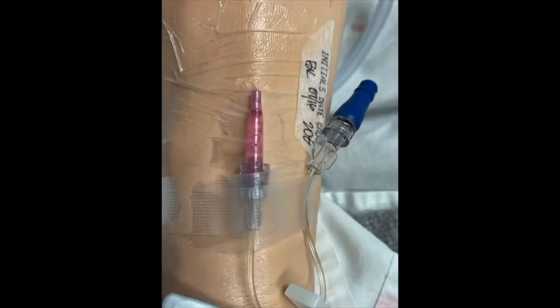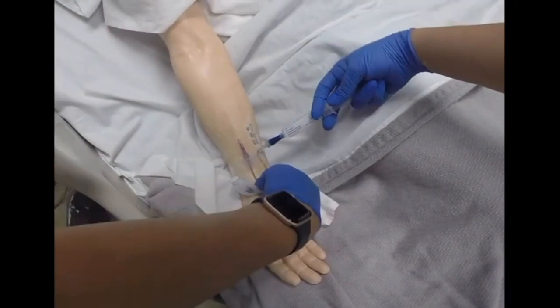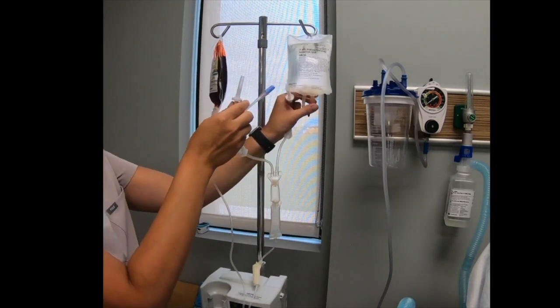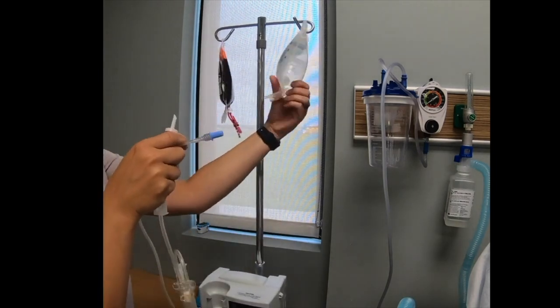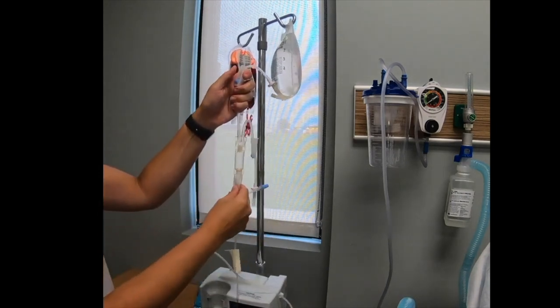Your patient must have at least a 20 gauge IV access. Once blood is verified, you must appropriately flush the patient's IV access. Verify blood return and then flush accordingly. In this case, we are using a Y-type blood administration setup, and always make sure that blood tubing has an inline filter. And aseptically remove the stopper from the normal saline bag. Uncover one spike and spike the saline bag, allowing the fluid to prime through the filter and the rest of the tubing.